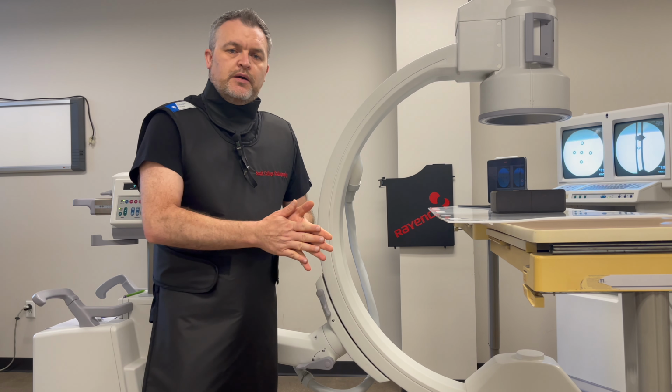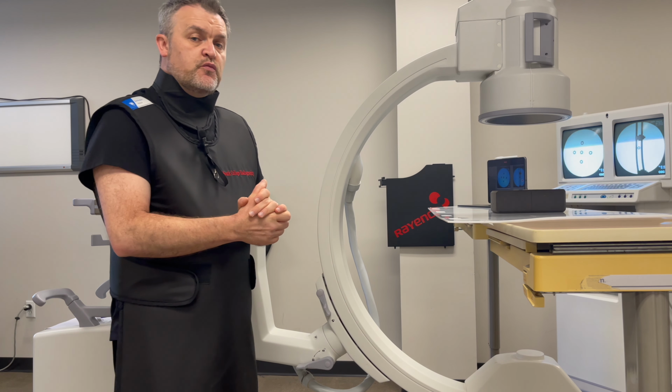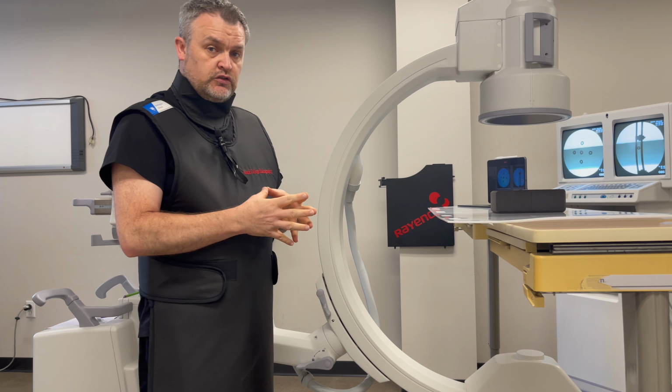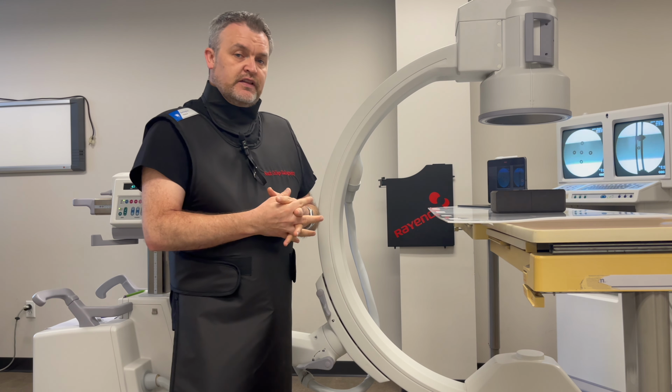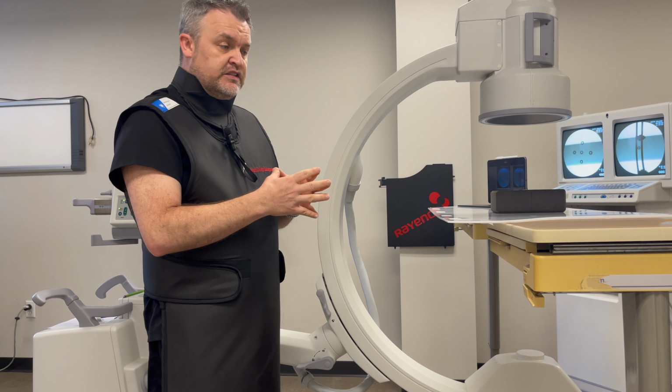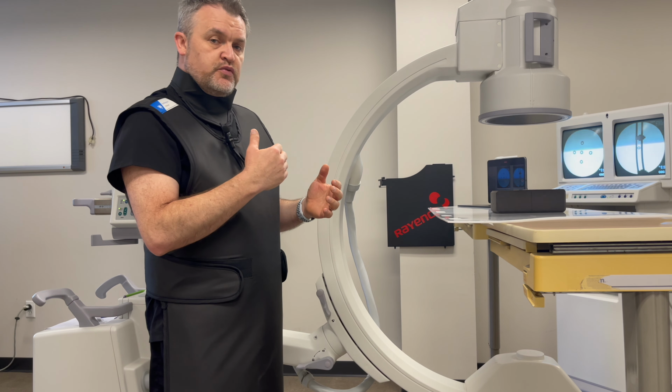Hi, so today I would like to demonstrate what I consider to be the primary function of an X-ray technologist working within surgery, and that is reproducibility. If you're doing fixation devices, you really have to provide the exact same image every time you come back to an angle so that the physician can truly assess the correction that they're making or the permanent fixation.